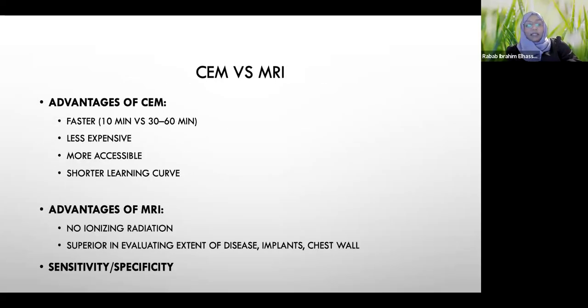As I mentioned, there are advantages of contrast enhanced mammogram over MRI. It's faster, it takes around 10 minutes for the whole procedure, versus up to an hour for the MRI. It's less expensive, more accessible, and better tolerated by patients. We did a survey in our unit.